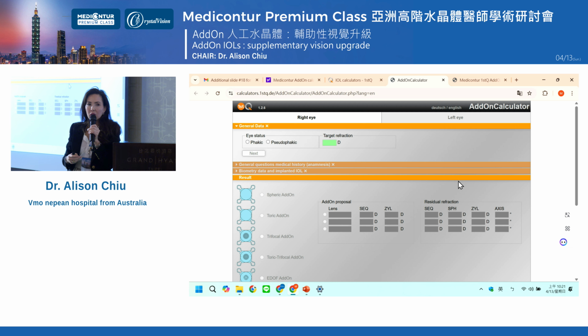But it sounds like a wonderful way to solve that near vision for the high myopes, which we know in the refractive setting, traditionally, unless we give them some myopia in their particular technology that we're using, monofocal, EDOF, trifocal, they never feel like the near vision is good enough. So this is a way to get them very happy with their near vision.